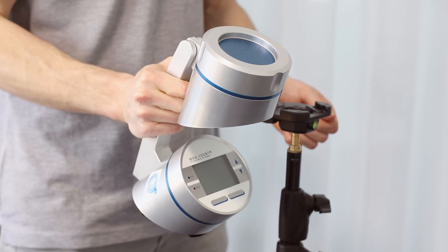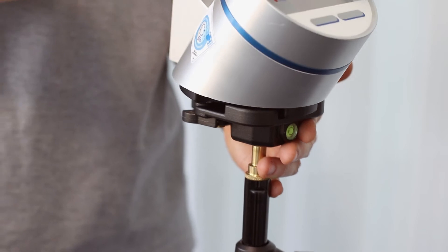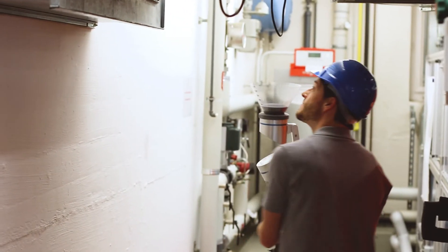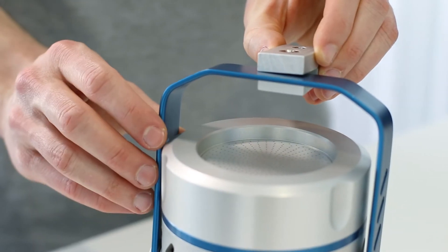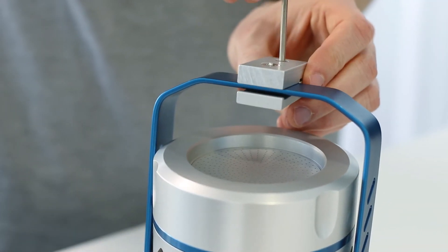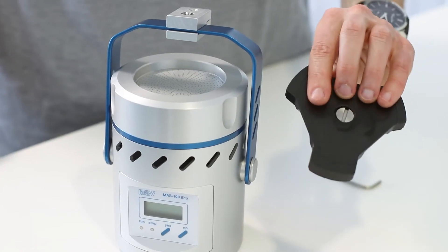Now I can simply click the air sampler into place, and so a stable transport to the ceiling outlet is guaranteed. Or for the MAS 100 eco: first I attach the tripod adapter to the handle of the air sampler, and afterwards I attach it to the adapter plate.